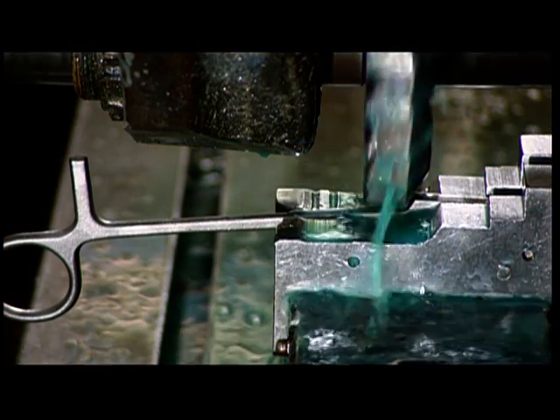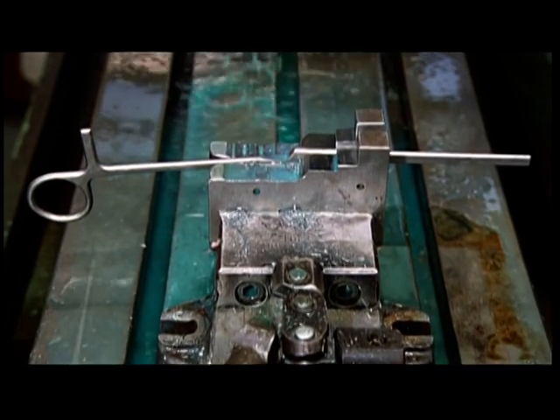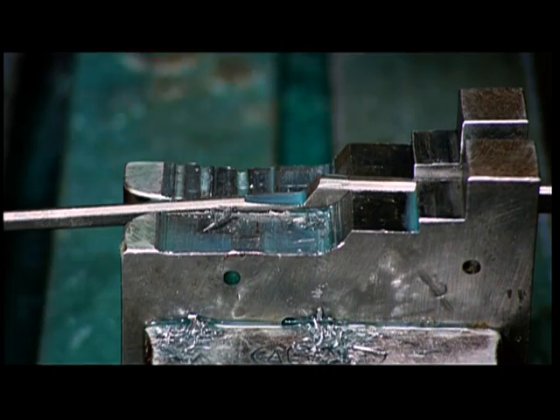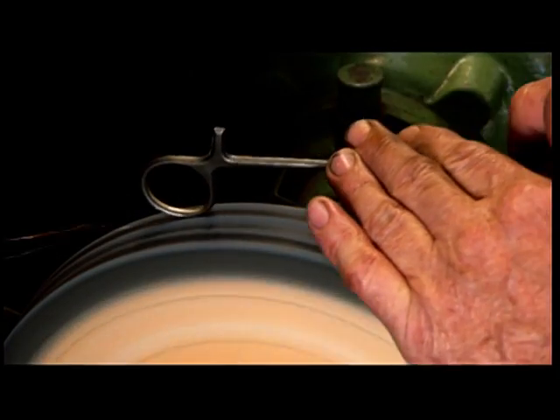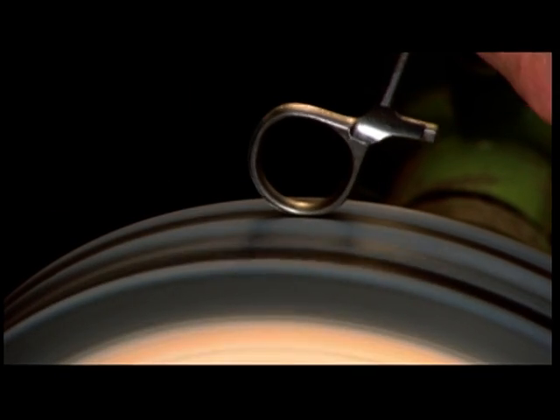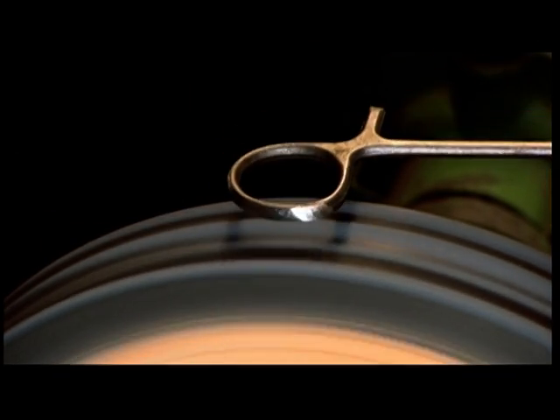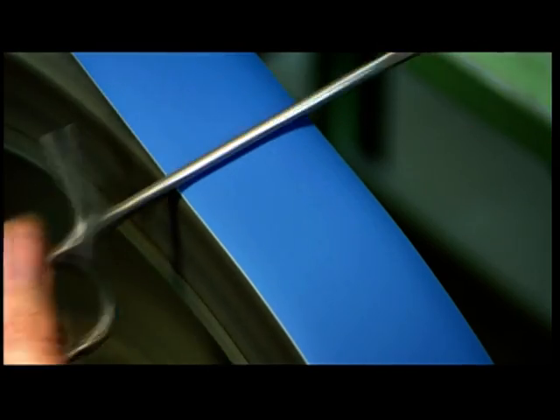Production now moves to the surgical clamp. It's used to block the flow of blood during operations and has a more scissors-like joint, rectangular instead of round. Mechanized cutters carve the joint and catches. A worker forces the finger bows against a spinning grinding wheel to remove surface imperfections. Precision is again critical, as the worker grinds each of the tool's shanks to the correct thickness.